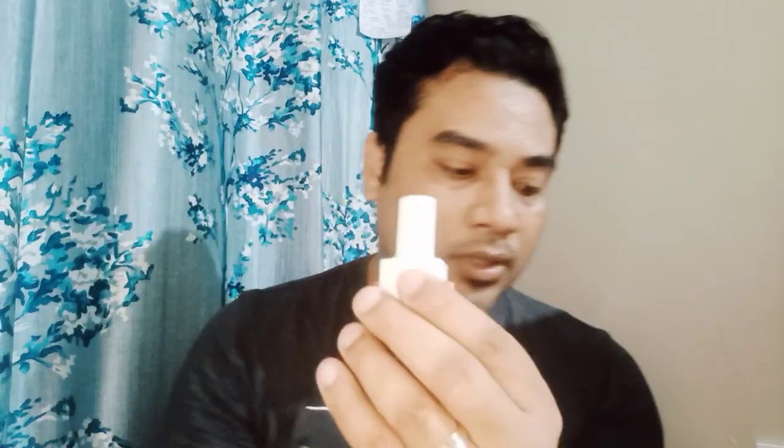Now listen to me. These steps are very important. First, you hold this with your left hand. There are two buttons on both sides. I'll first dictate the procedure, then I will demonstrate it, first from the front side, then from sideways. First, I'll say out the procedure.